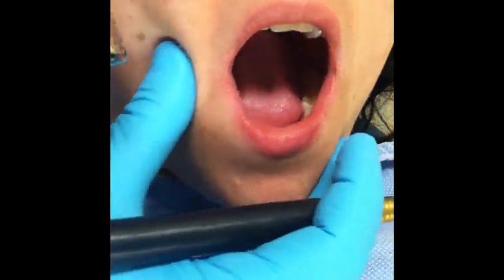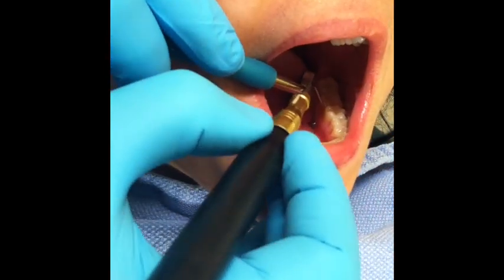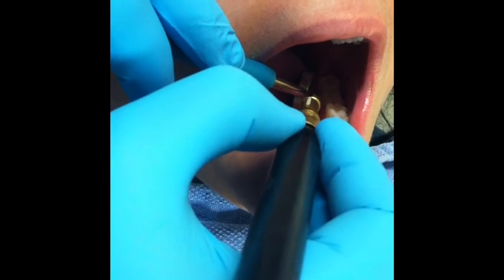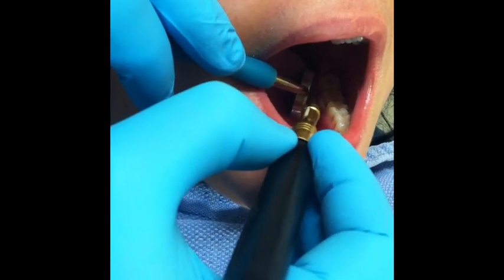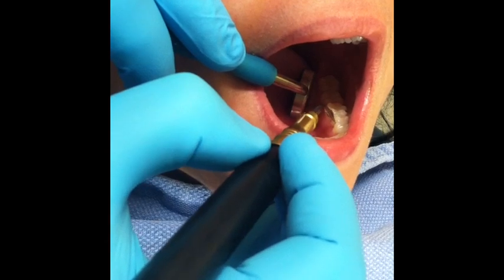Here I'm just switching over to the suction mirror - just unhooking the Kona block tube set and hooking in the suction mirror, which gives you a nice, strong HVE suction. This position right here is probably the most effective use of the suction mirror. You can just really scale very well, non-stop, and it really suctions up everything.